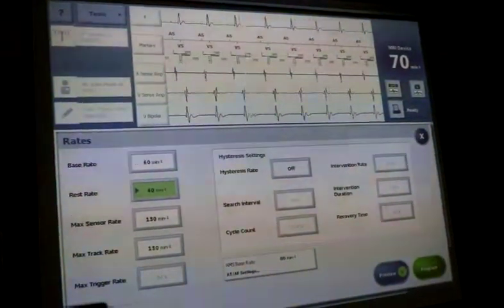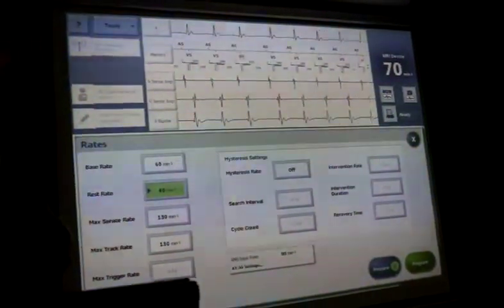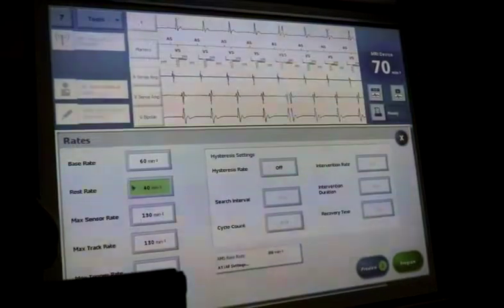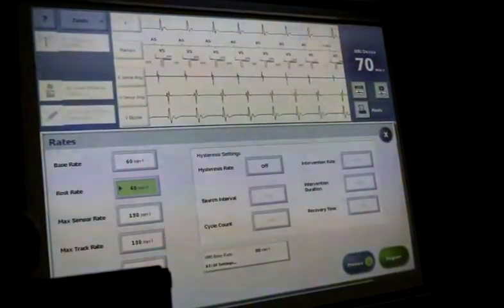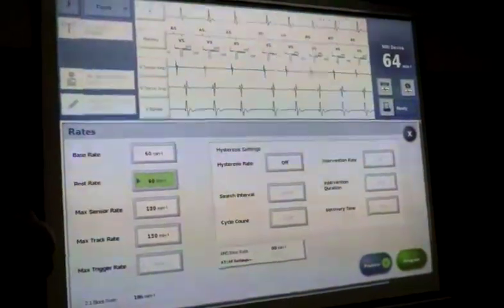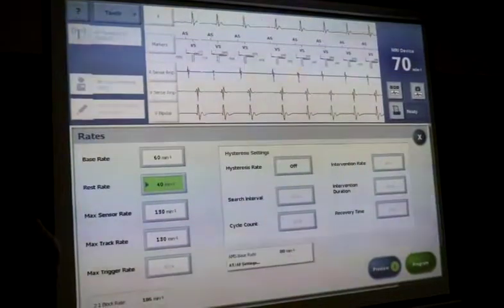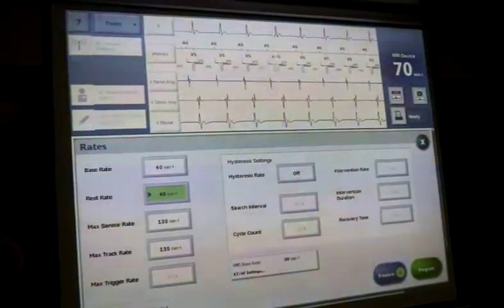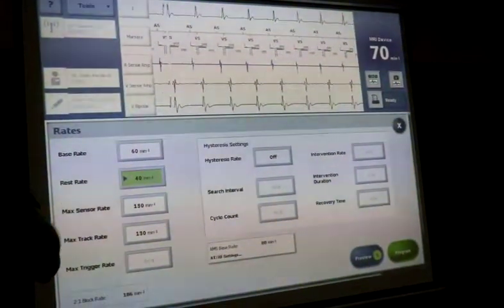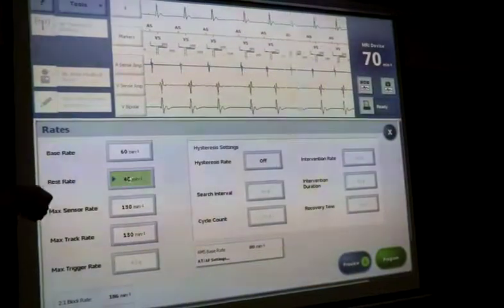If we don't do this, we're going to pace her in her atrium at 60 beats per minute, probably 1/3 of her life, because they're asleep for maybe 8 hours, right? So you're going to pace them when you don't need to for 30% of the time. That's a waste of battery, right? Don't do that. They don't need it, and it might not let them sleep very well. So rest rate is really helpful. It will save your battery a little bit, and it will stop delivering inappropriate atrial pacing. Pacing that is not required, okay? So this is a good idea.